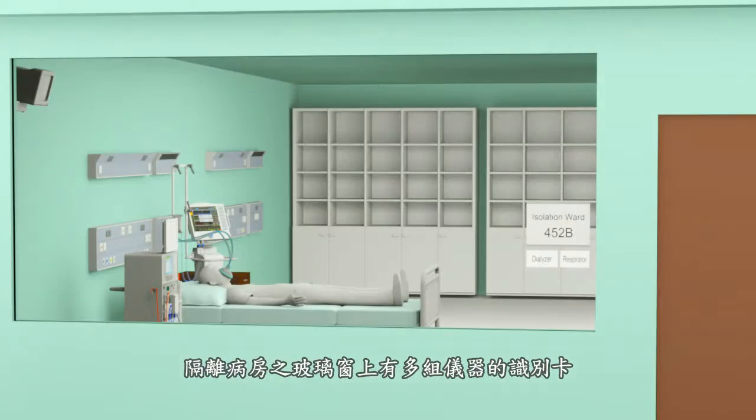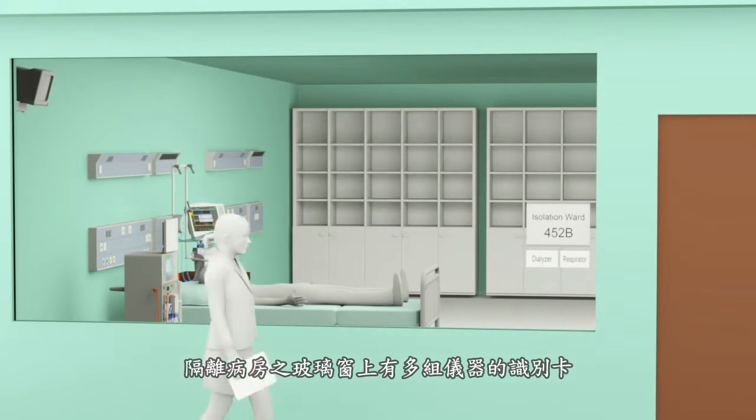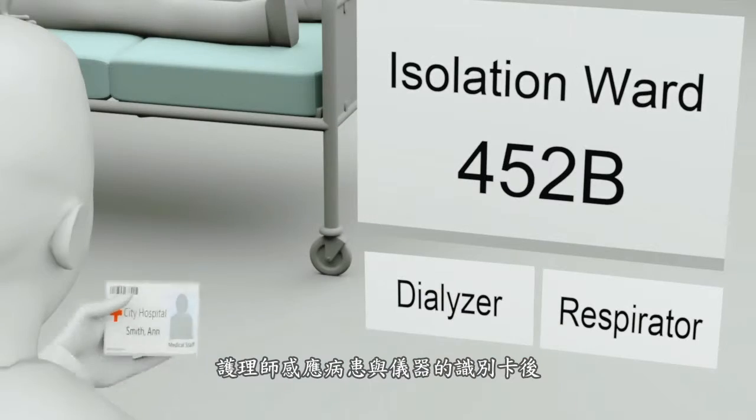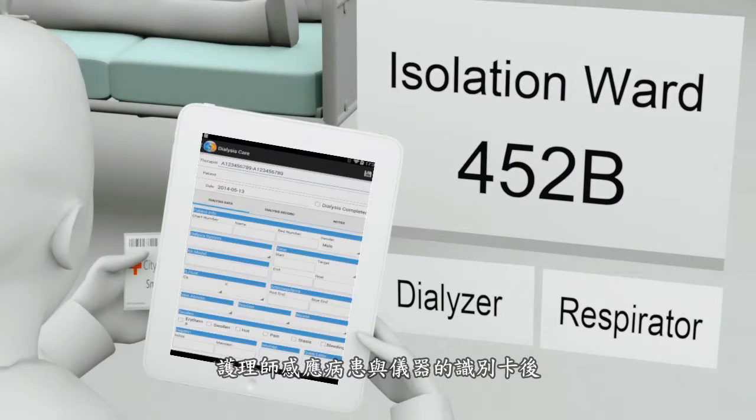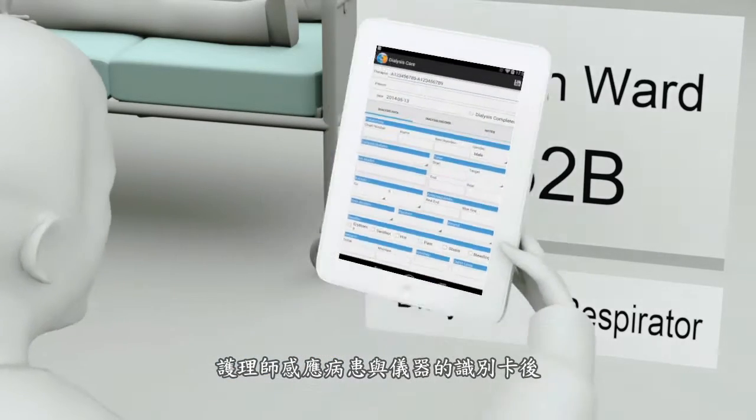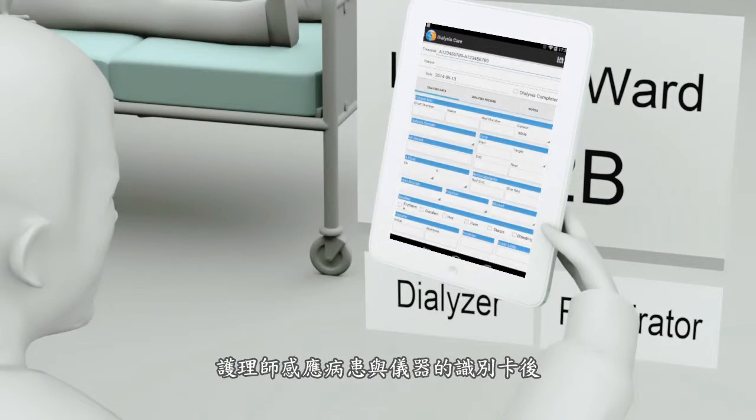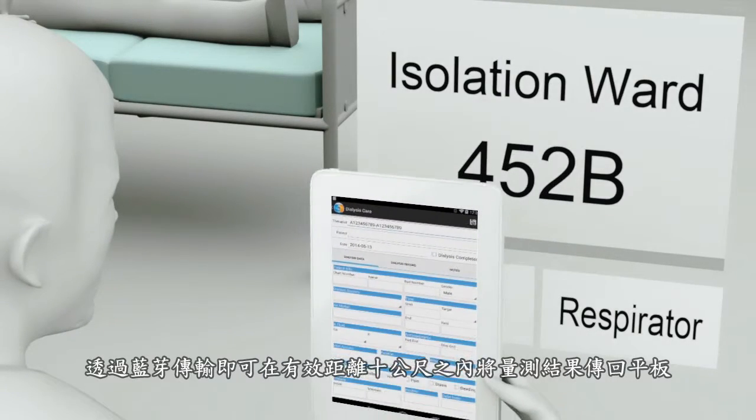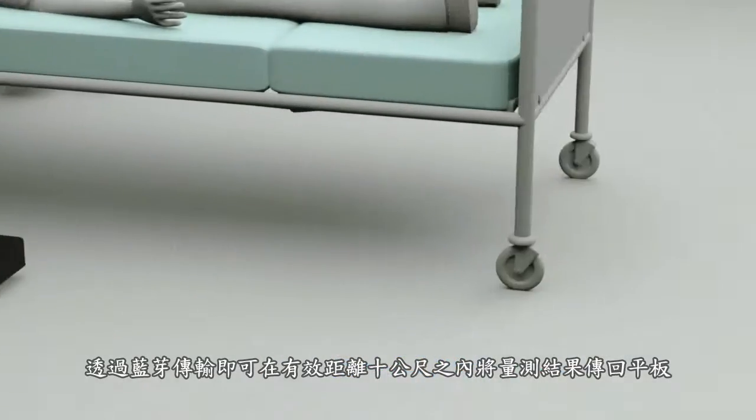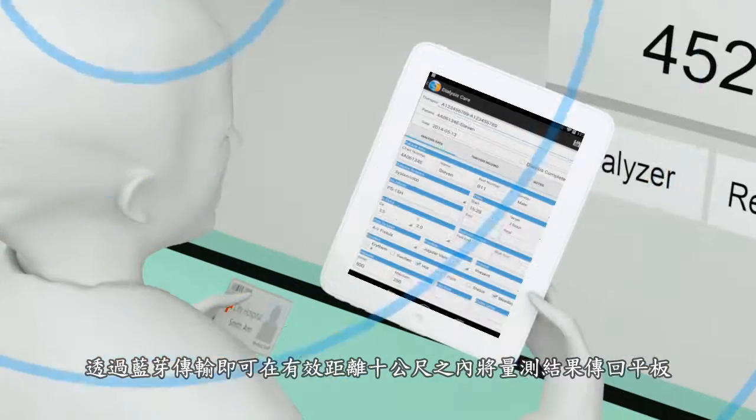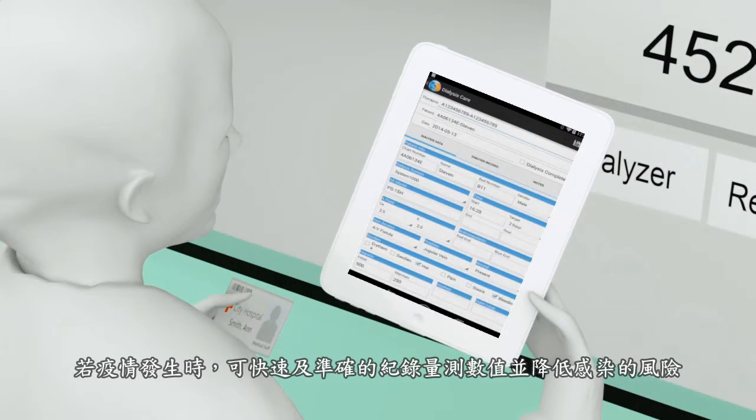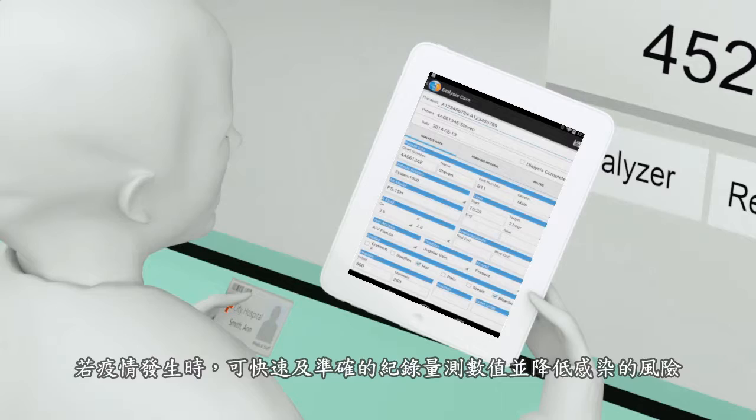Scanning the barcode or RFID outside of isolation ward enables quick and easy vital sign data capturing. With effective distance up to 10 meters, data is transmitted to staff outside the room, completing various medical device data logging.